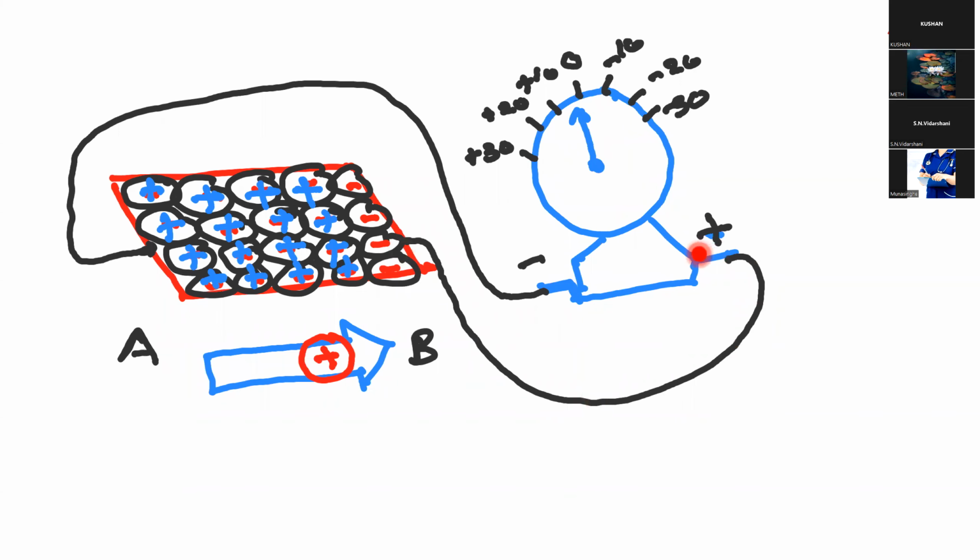The positive electrode of the galvanometer. Understand this scenario, okay? Understand this concept properly. This is the major concept that you use in the whole ECG. Please concentrate. There is no magic, there is no rocket science. It's very easy, but remember this concept.